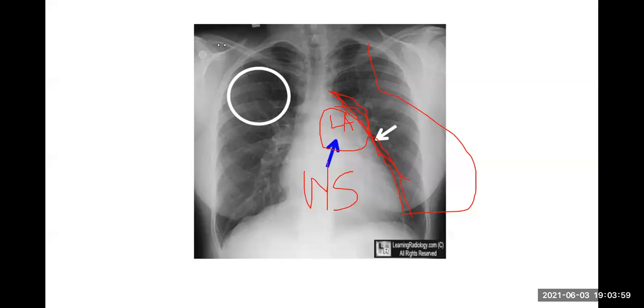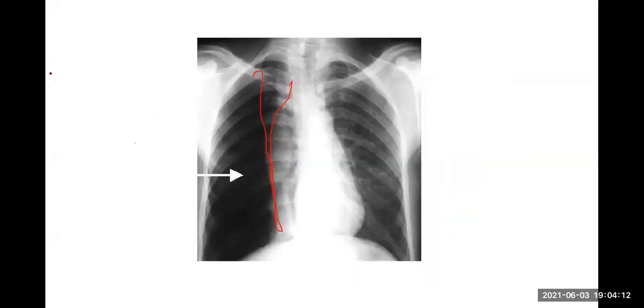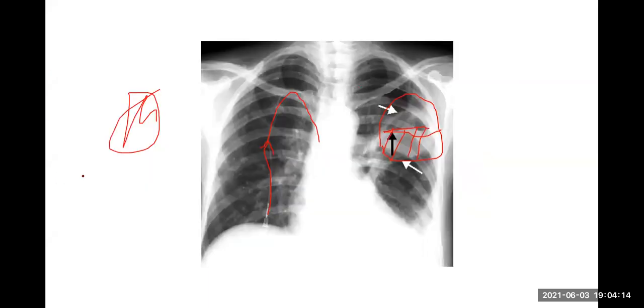Sir, how does apical fibrosis look? I didn't show that, did I? Right. I will show you on a different day. I don't have an X-ray now to show you. But it essentially looks quite similar to consolidation, but with a lot of volume loss. Sorry, I forgot to put that in here.